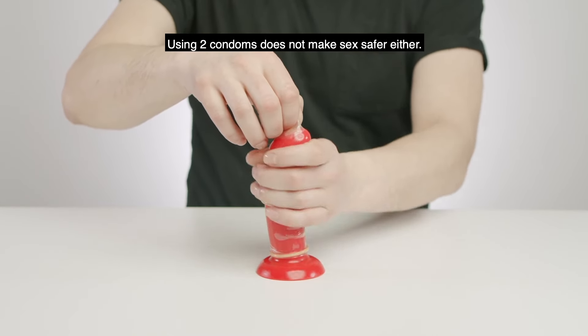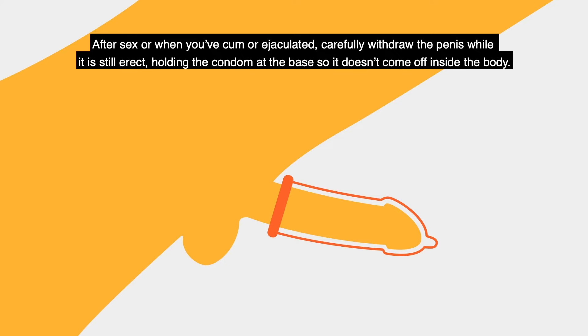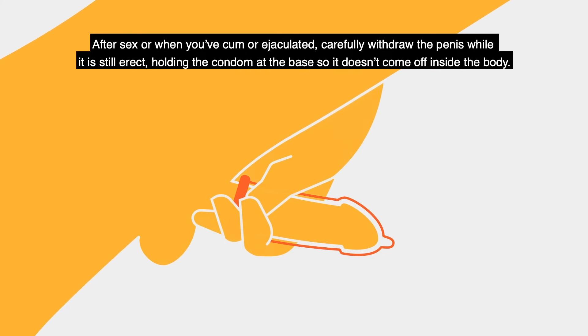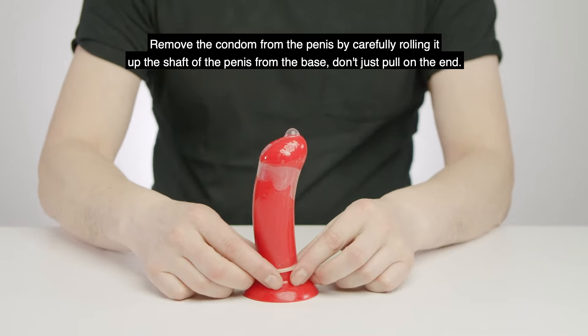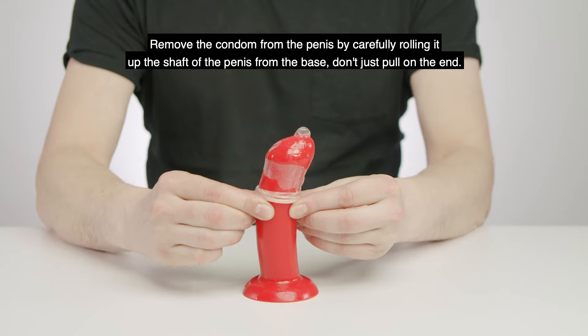Using two condoms does not make sex safer either. After sex, or when you've ejaculated, carefully withdraw the penis while it is still erect, holding the condom at the base so it doesn't come off inside the body. Remove the condom from the penis by carefully rolling it up the shaft from the base — don't just pull it at the end.